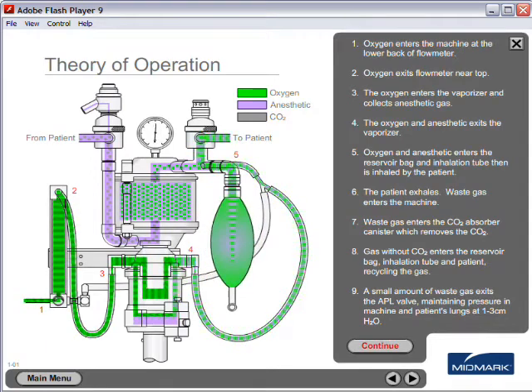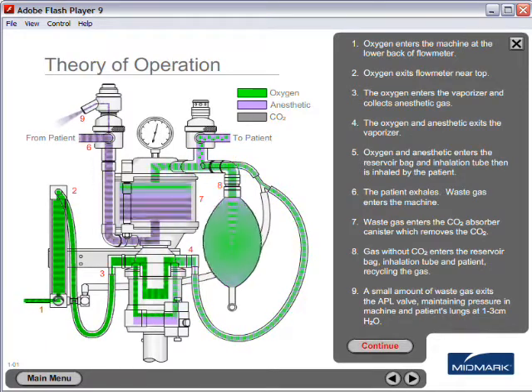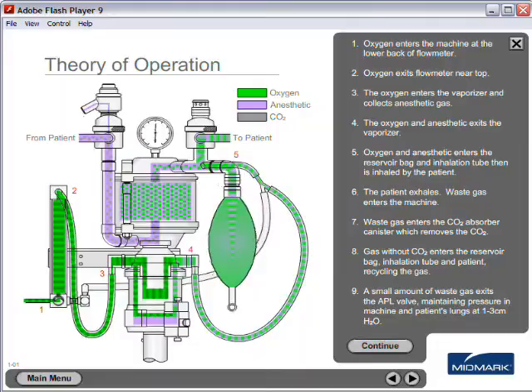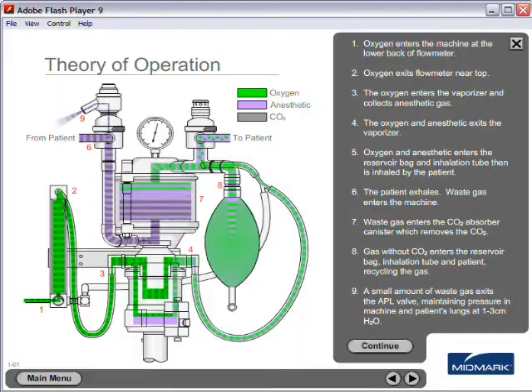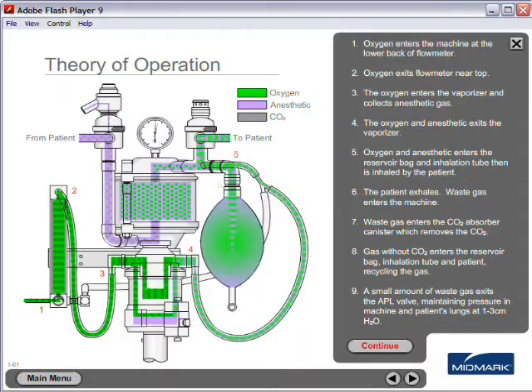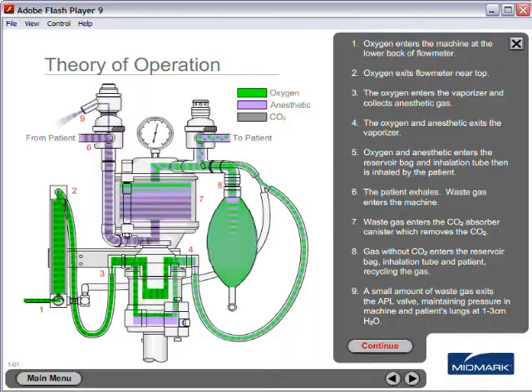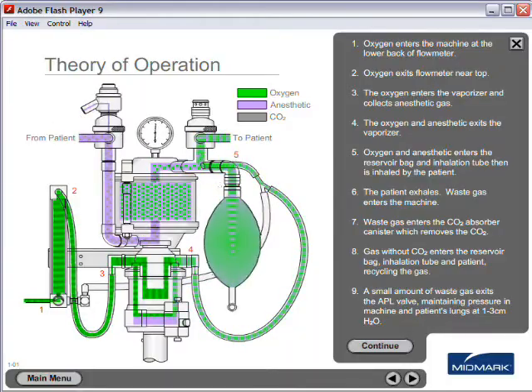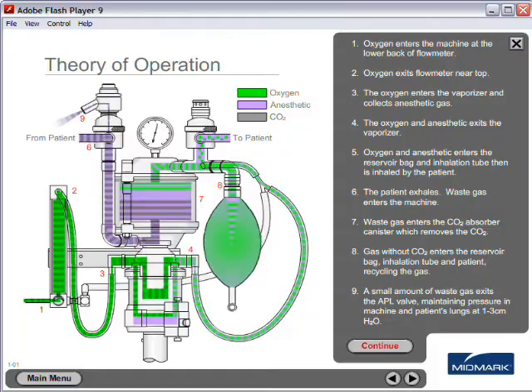Theory of operation. Oxygen enters the machine at the lower back of the flow meter, then exits the flow meter near the top.